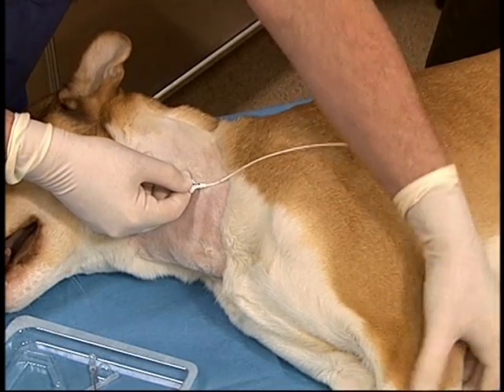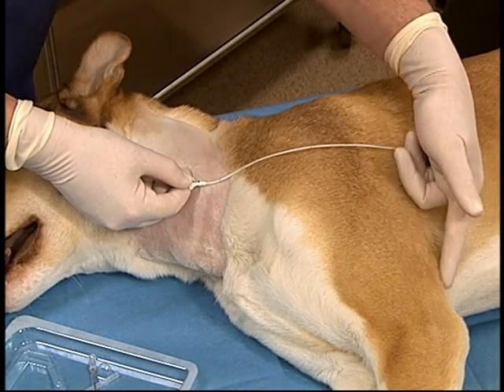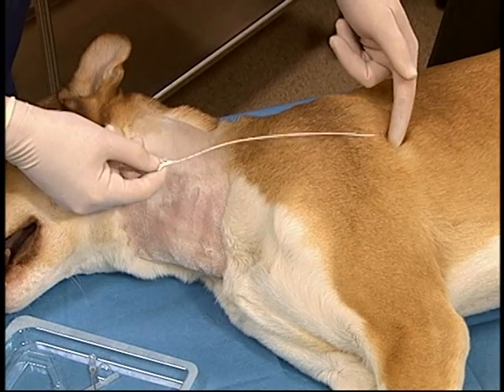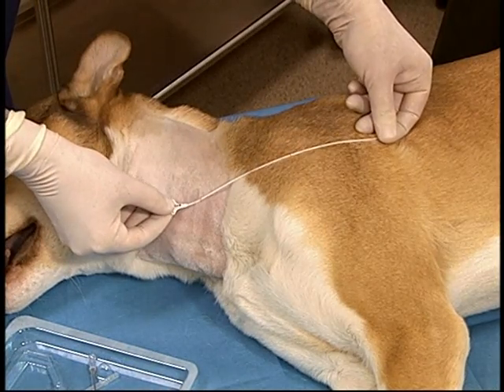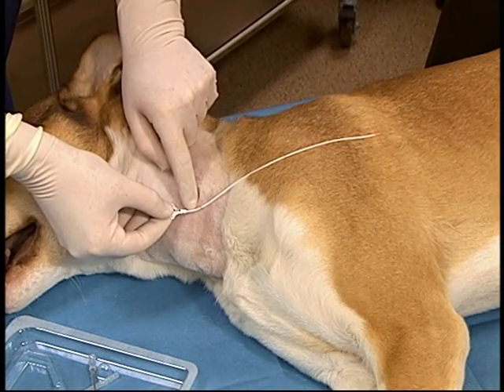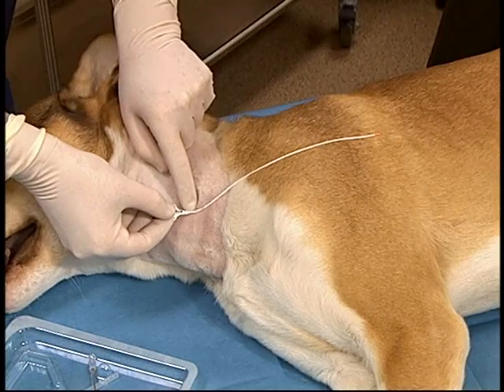The catheter is pre-measured to an appropriate length, which is approximately the fourth intercostal space when using the jugular vein, in order that central venous pressure measurement can be done. An imaginary line is drawn from the caudal aspect of the elbow with the limb in a neutral position up to a level that is in line with the venotomy site.